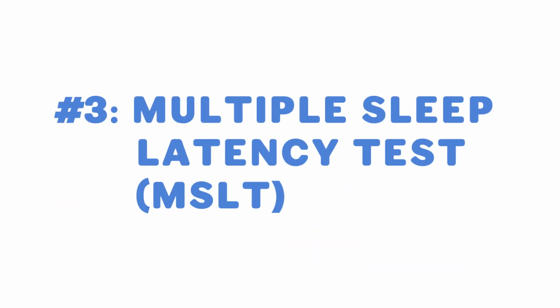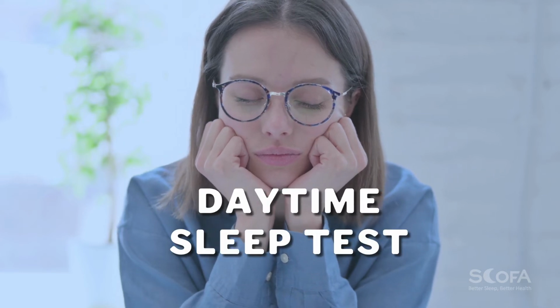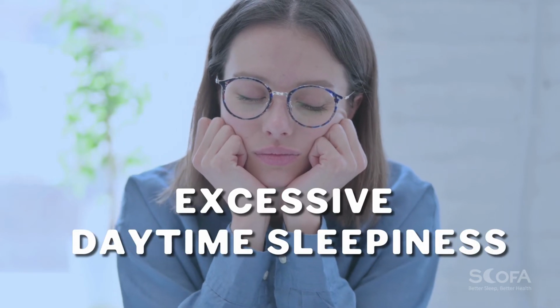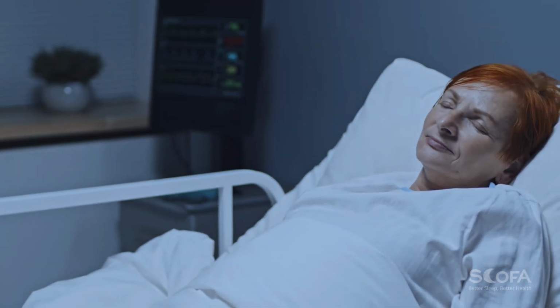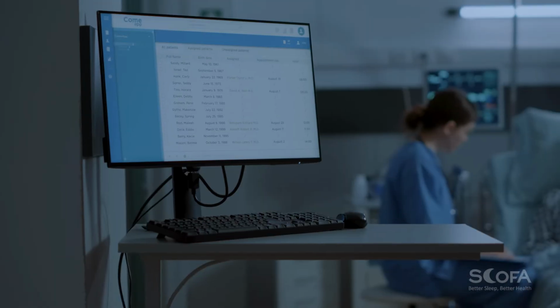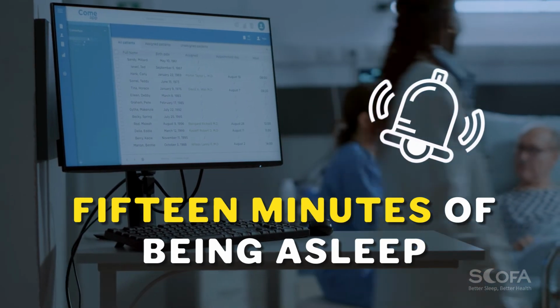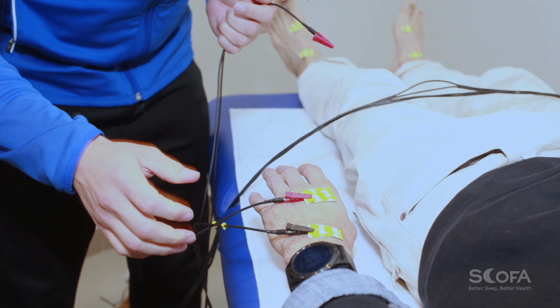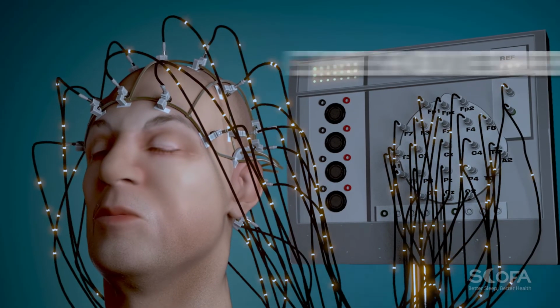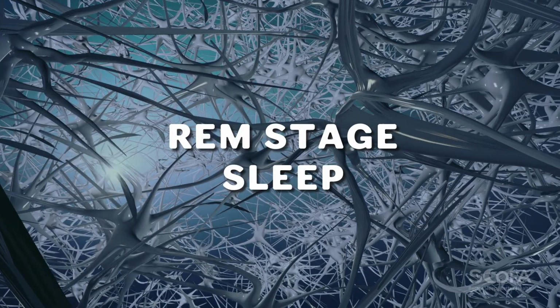3. Multiple Sleep Latency Test, MSLT. Unlike the other 2 options, this is a daytime sleep test, and it is for people experiencing excessive daytime sleepiness. It involves 5 scheduled naps, which are usually 2 hours apart. You will be given 20 minutes to fall asleep and will be woken up after 15 minutes of being asleep. During the test, sensors will be connected to you to monitor your eye movement and brain activity to determine how quickly you fall asleep and if you are reaching the REM stage sleep or not.